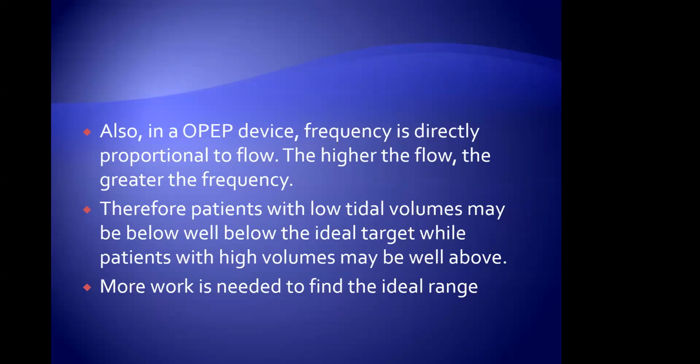So as you're placing your healing hands on that patient and working up your care plan and articulating it, it is based on that specific patient. So whatever's needed to treat that patient, not in a global sense. Remember we talked about the family practice physician doing mechanical ventilation who says, oh yeah, let's put them on a PEEP of 5. Well, okay, that's generic. No, we don't do that.